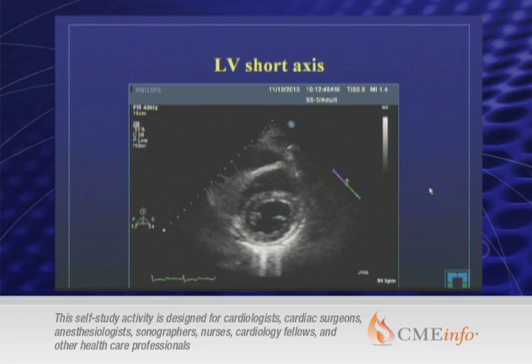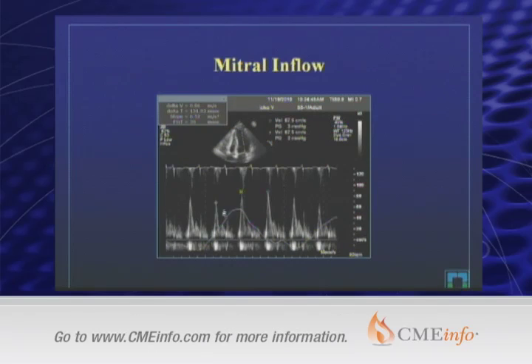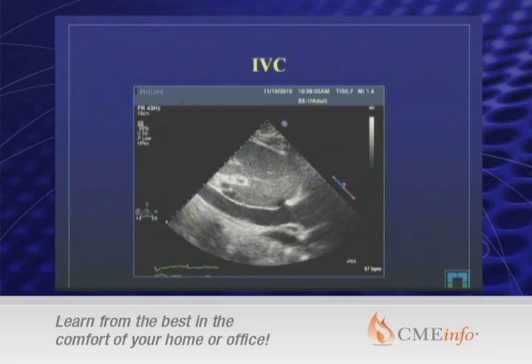That was the four-chamber view. This is the short axis. Here's the mitral inflow. Here we have a respirometer — here's inspiration, here's expiration. Deceleration time was around 130 milliseconds. The IVC was enlarged.